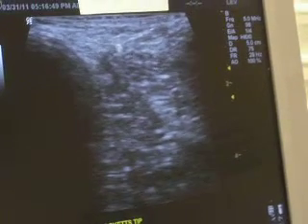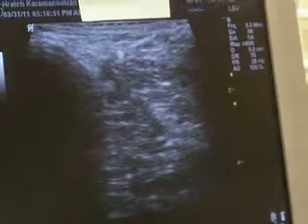We're going to put tumescent anesthesia. The tumescent anesthesia is going to go around the vein and collapse it. See it right there, expanding around it.